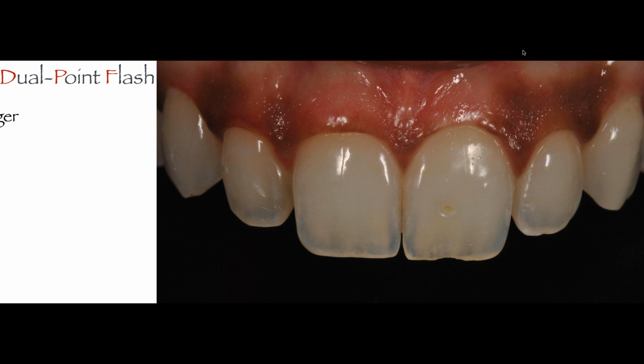What is the difference between this photo and the previous photo? You see, now I'm controlling the light better. We have some shadows. There's less light involved in the photo. So if there's less light, the actual photo is going to show me more detail. Now, when I say detail, what am I referring to?